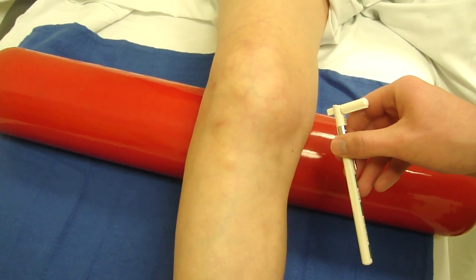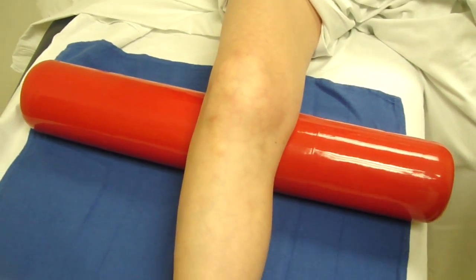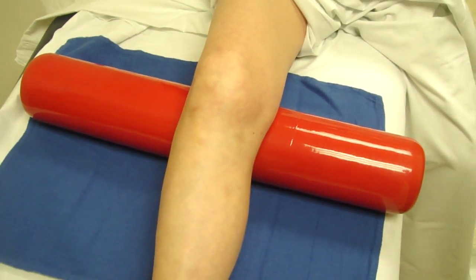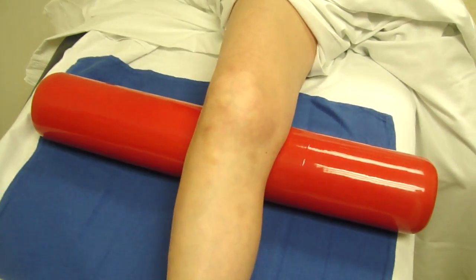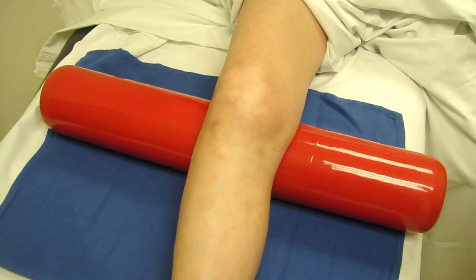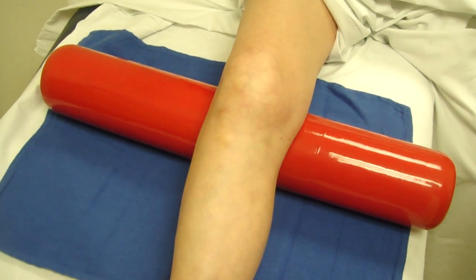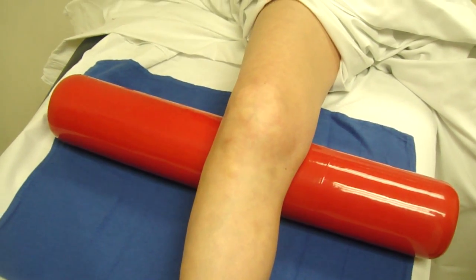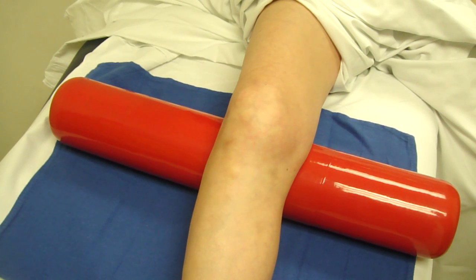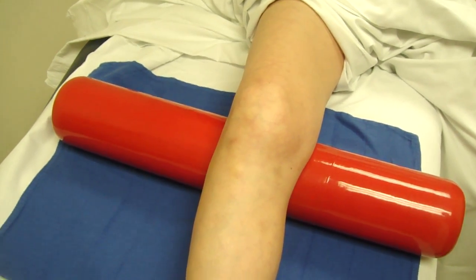I can't feel that at all. The purpose is to determine the threshold, or lowest stimulus, that the patient can perceive. The final threshold is determined through calculating the geometric mean.